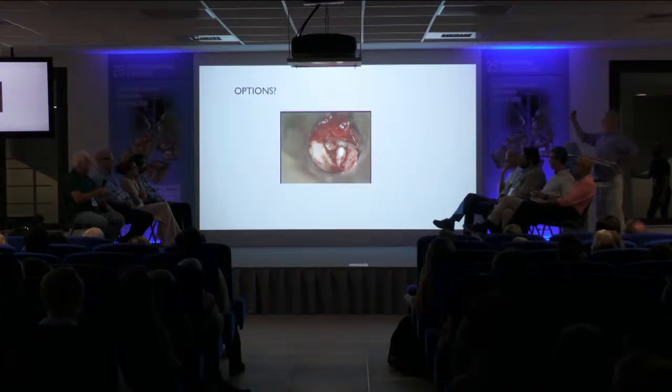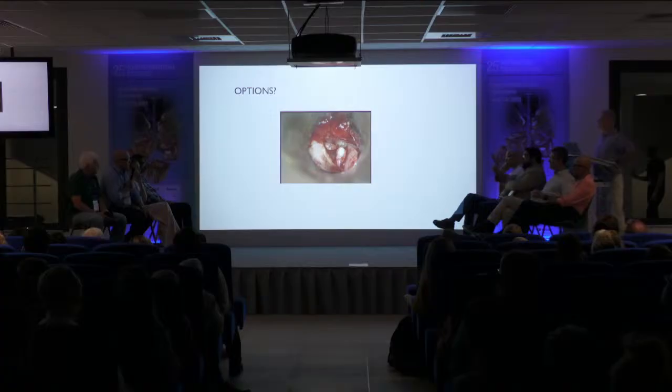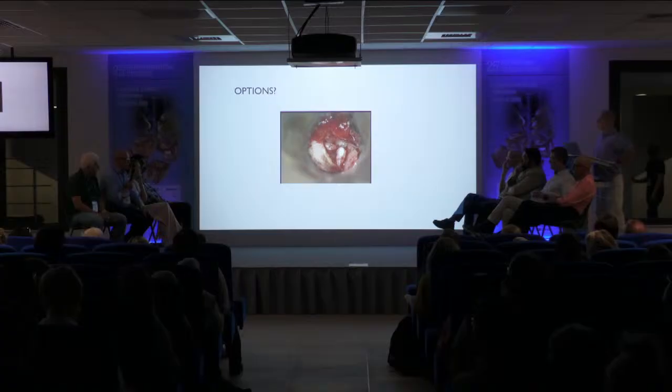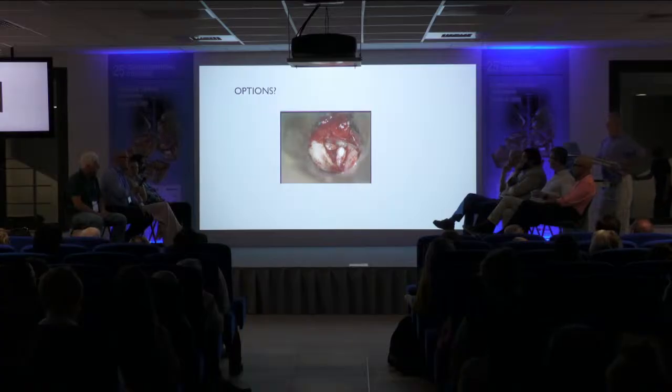Okay, and how about the approach in the clinic here? For myself, I would perform a large reinforcement of the tympanic membrane with cartilage, because first the problem is the retraction. And then under it, a titanium prosthesis. And which one do you actually use in the clinic here? The middle one. The middle clip, which looks very much like the Kurz that I showed you. Okay. Good. I think we're going to move on from that case.